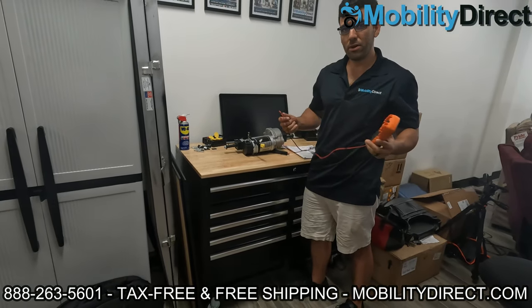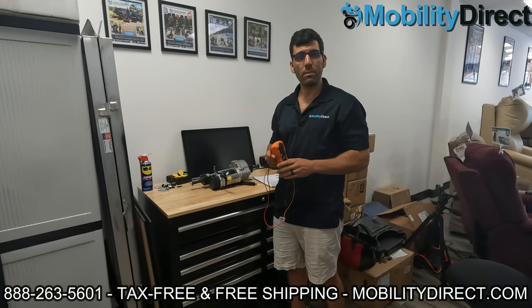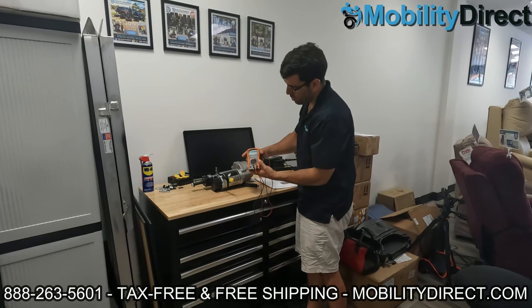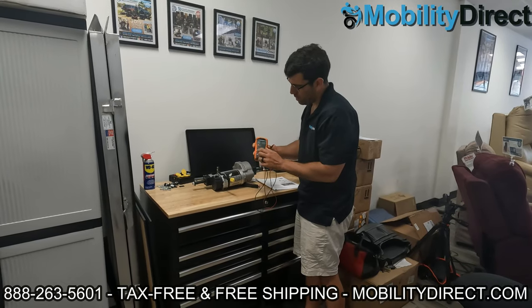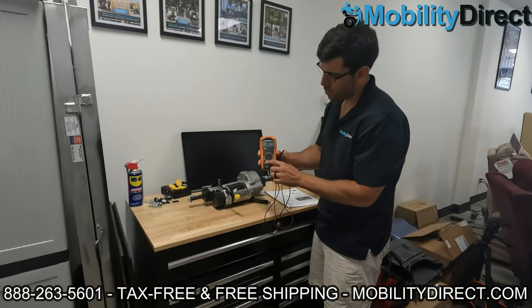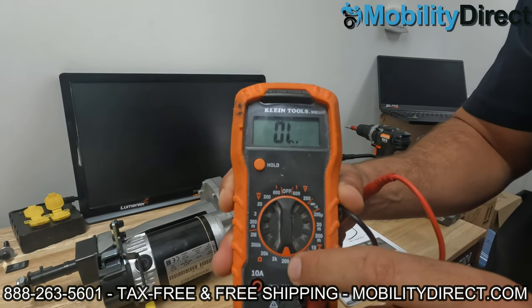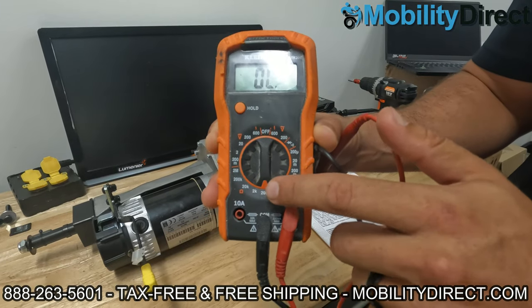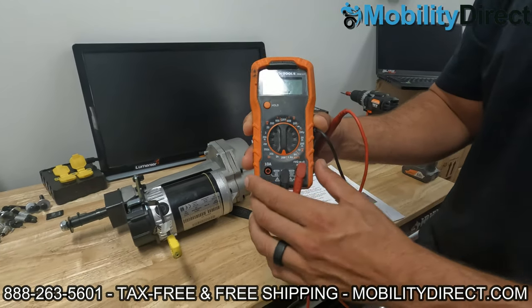Now, if you haven't already seen our other videos, you know that multimeters are a must-have tool if you're troubleshooting parts on a mobility scooter. What we're going to do is set it to the resistance setting. We're going to put it at 200, and it's testing ohms — that omega sign there, the orange little omega sign. You can put it at 200, 2K, 20K, 200K, or even 2 million. 200 is fine in this case because the reading is going to be well under 2000.